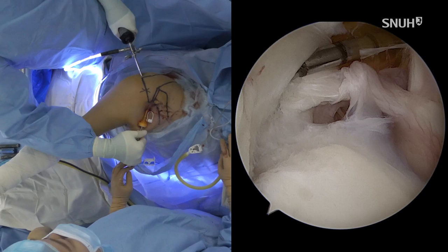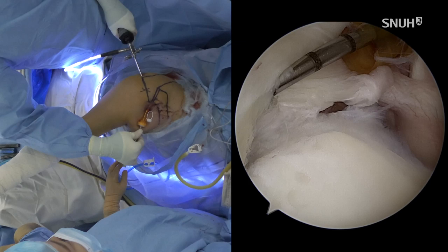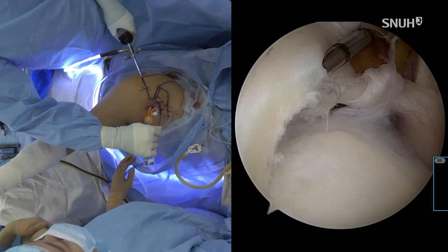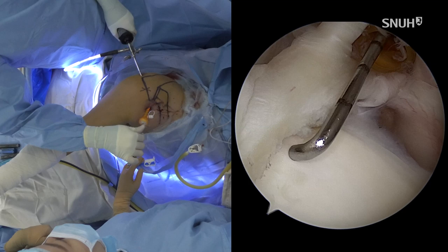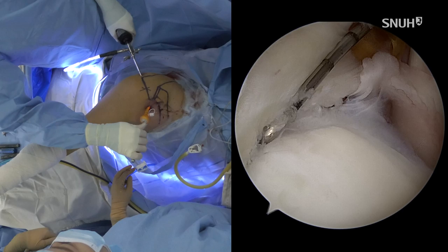But as I said before, the full removal of the cyst wall is not important, just disruption of the checking valve system, that is important for cyst management. Some surgeons go through the cyst, look at the cyst, and remove the cyst wall, but I don't think it is necessary. Sometimes the suprascapular nerve can be damaged through that procedure.